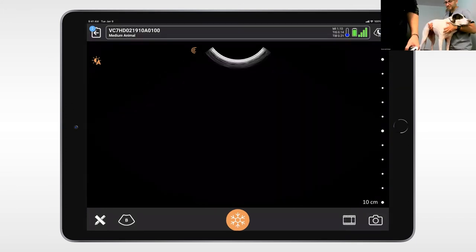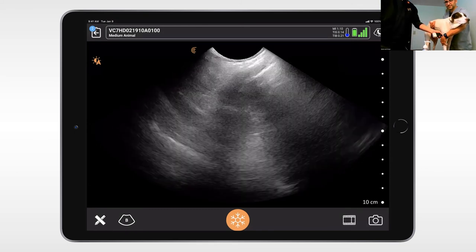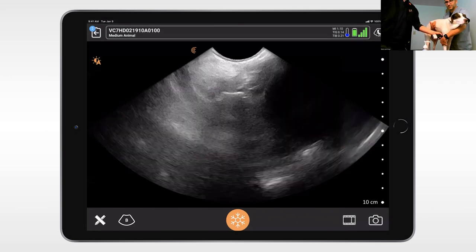All right, so simple. All we're going to do is have our dog standing. That's the more realistic position we're going to scan in. Serge will pull the right limb a little bit forward, which makes it a little easier. We'll apply our gelcohol, a combination of gel and alcohol in this situation, and then put the marker towards the elbow. Nice. And all we're going to do then is find the heart. So you can see we've got the heart here.